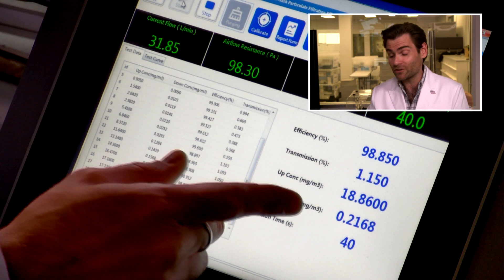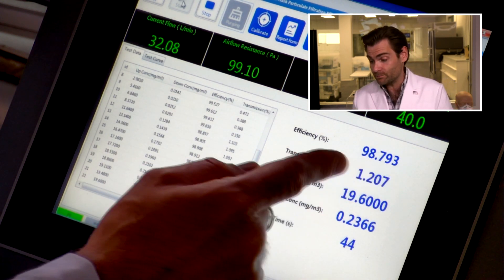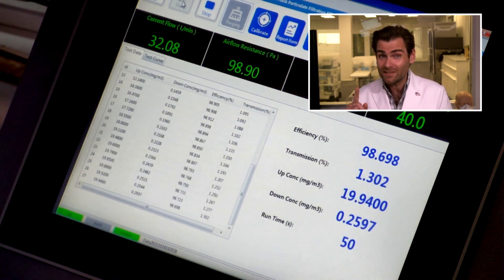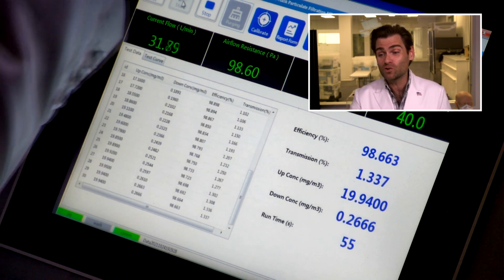I can already tell you this is a really good mask. I'm just going to ruin the surprise — look at this. Remember, an N95 needs to be 95% efficiency, but look at this airflow resistance: under 100 pascals. We've seen that a few times with some other N95 manufacturers, but that is super, super breathable material, which I love to see. That means you can wear this all day long.